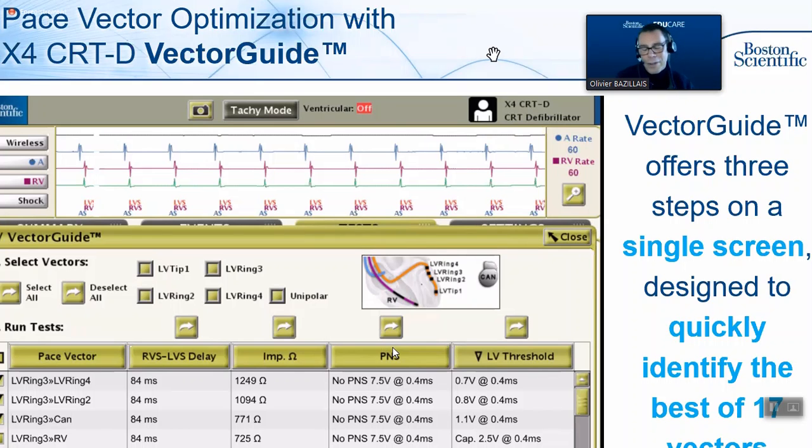Do you see phrenic stimulation? Yes, no. And LV threshold. You can also use what we call a fixed output, meaning the device will just deliver 2.5. Do you see capture? Yes, no. So you can rapidly populate all fields. And then, of course, ultimately, you will focus on the lead with the longest RVS-LVS delay. The vector guide is really key to identify the best of the 17 vectors you can program with the quadrupolar lead.